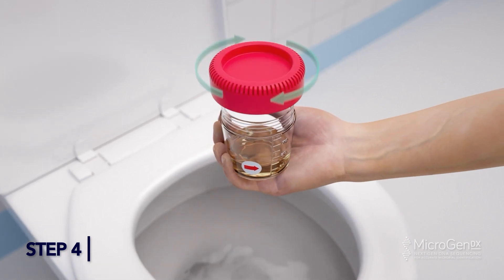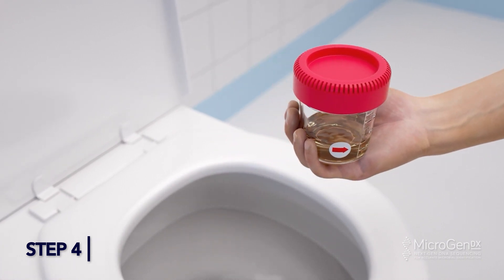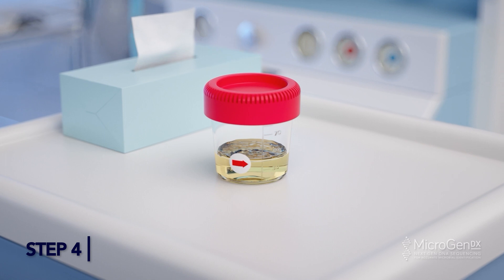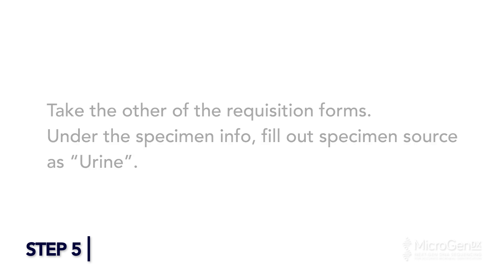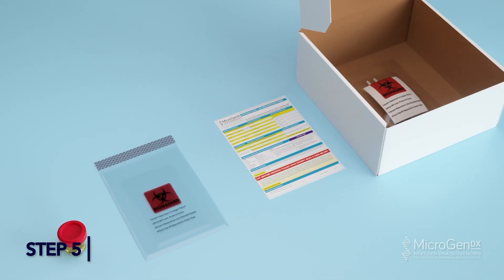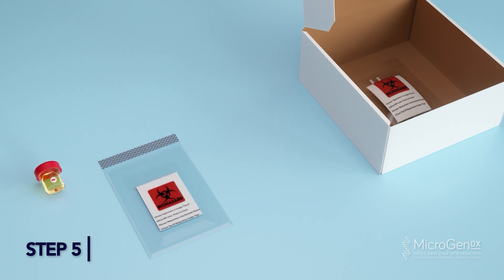Step 5: Secure the lid tightly by placing the lid directly on the cup and turning until you hear two clicks. This indicates the cup is locked. Take one of the requisition forms and under specimen info, fill out specimen source as urine. Place your completed MicroGenDX lab requisition form in the front pocket of the BioBag. Place the 90ml collection cup inside the larger pocket of the BioBag.